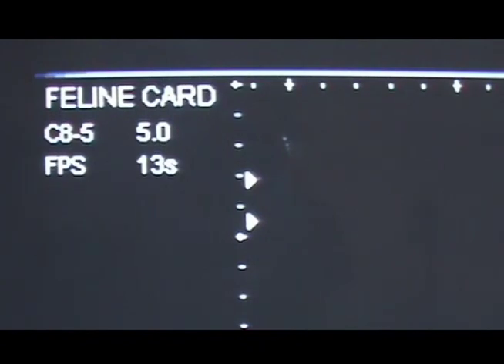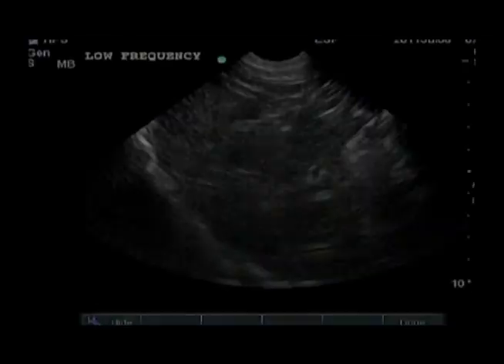Most ultrasound machines have buttons, knobs, or toggles that allow you to change frequency of the ultrasound beam. Current frequency of the ultrasound beam will be listed somewhere on the ultrasound screen. Find and study this function on your machine. Some ultrasound machines adjust frequency for you as you adjust depth.